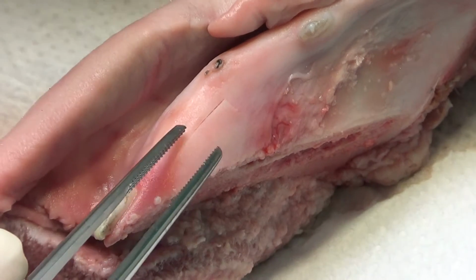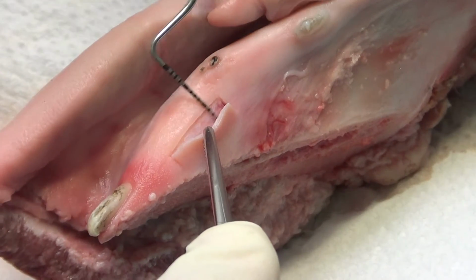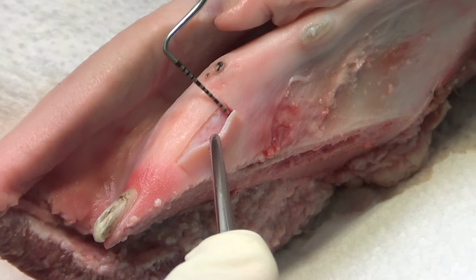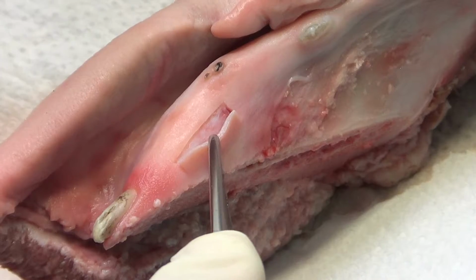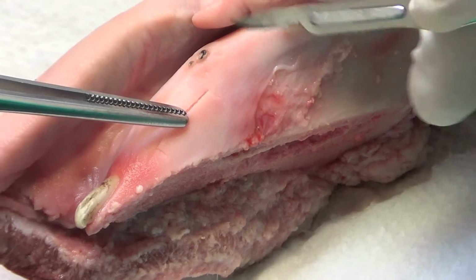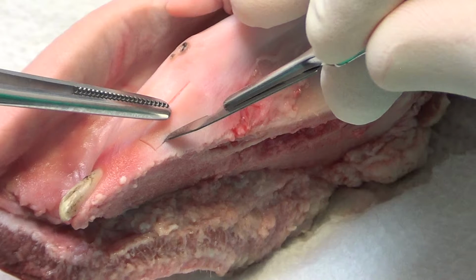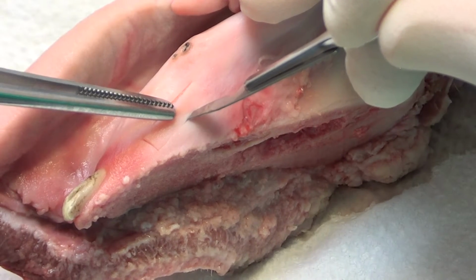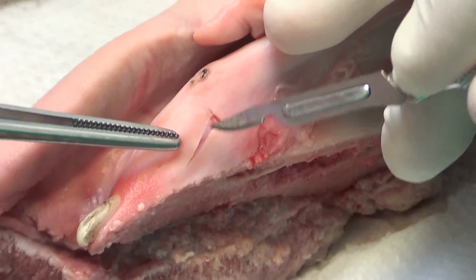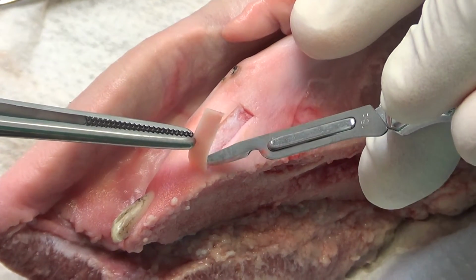And the probe doesn't interrupt, as you can see. If you feel some interference, you have to cut it out, okay? Because at the end, when you go to do the fourth incision, you can perfectly cut it out. If you have a little bit of interference, you can cut it.